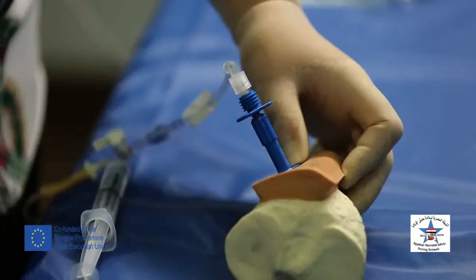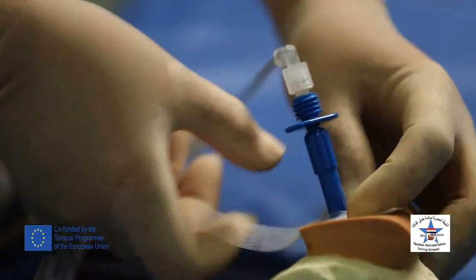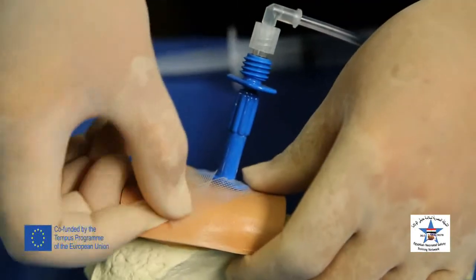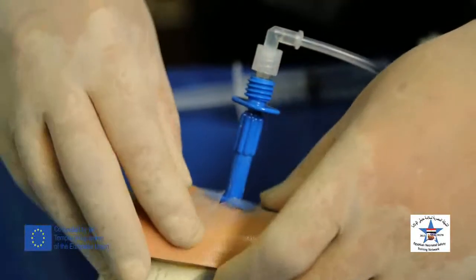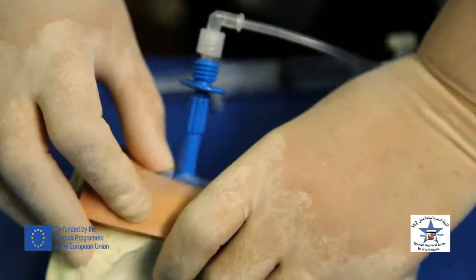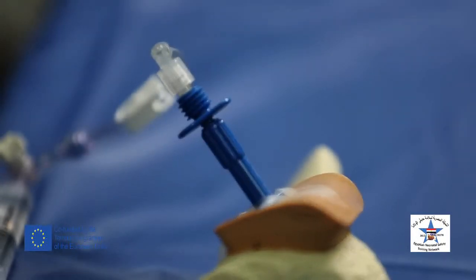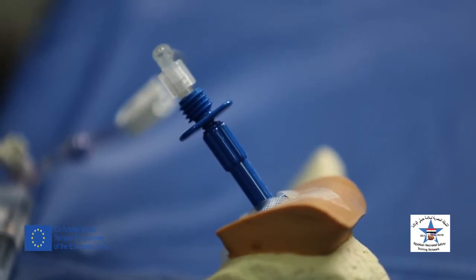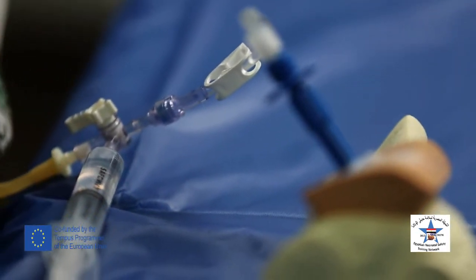We fix the cannula in place with plaster, like this. The intraosseous cannula can be inserted for 24 hours at most, until another vascular access is obtained, either through peripheral or central lines.